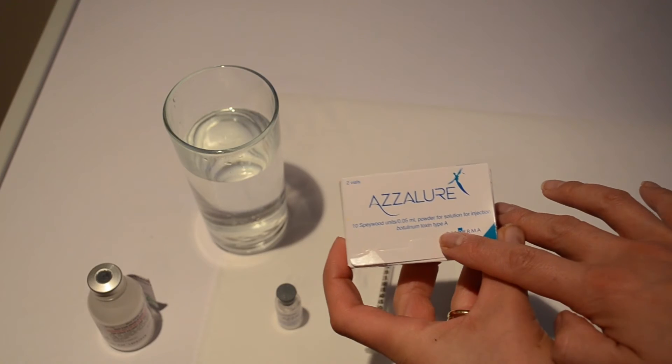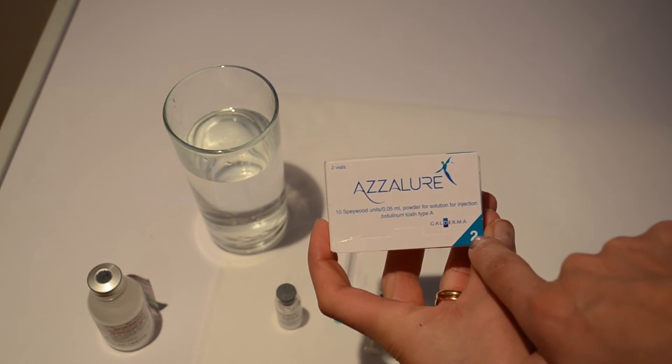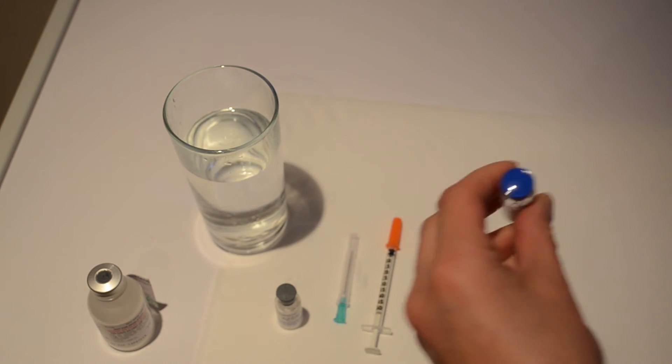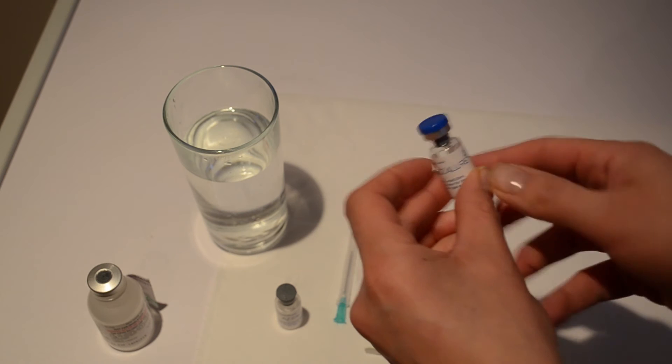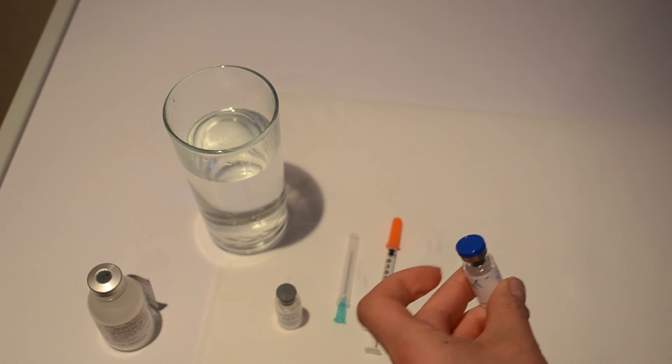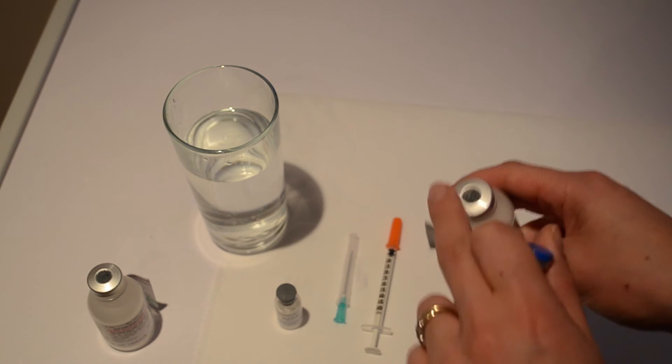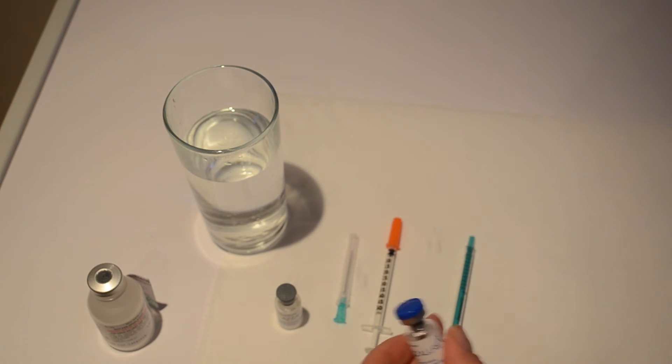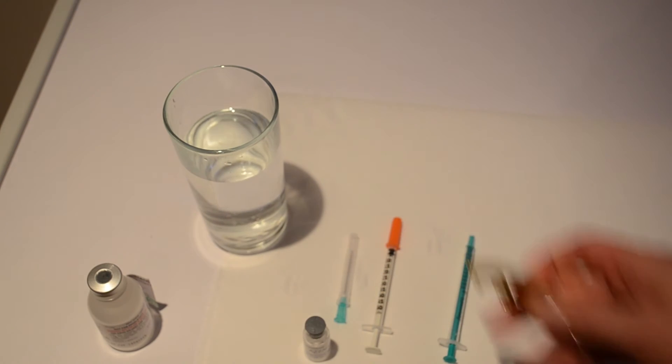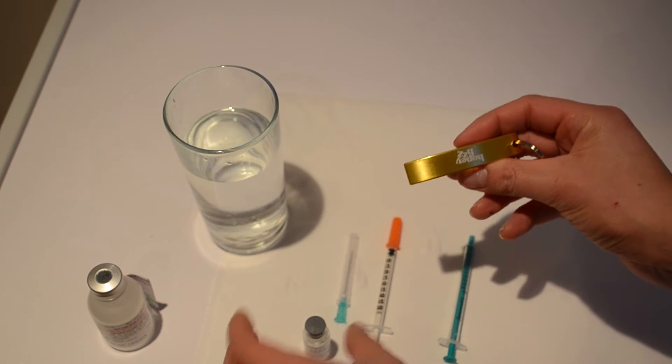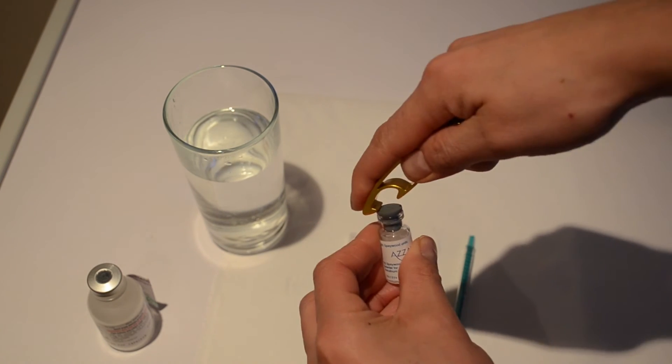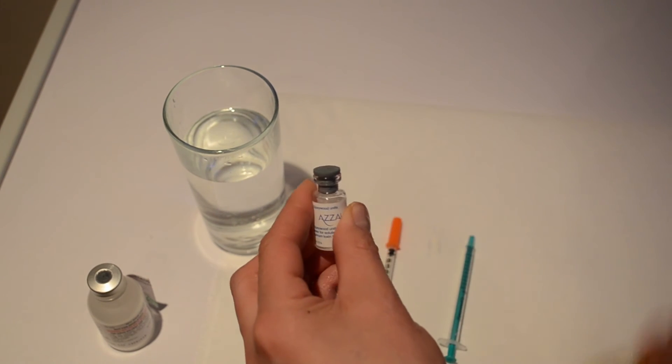Then you're going to have a box of AZZALURE maybe with two in a box and they come like this so you'll have the blue lid and you'll have a metal rim around the bung. A little bit like this saline rim. And so what you'll need to do is you need to pull the cap off this. In your starter kit you'll find that you get a decapper so you'll be able to pull that metal cap off your AZZALURE vial.